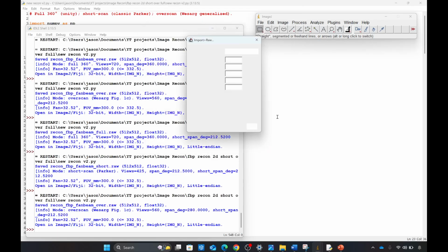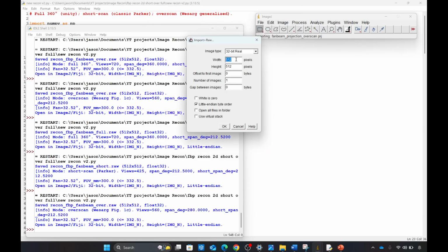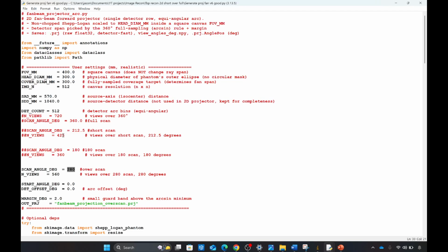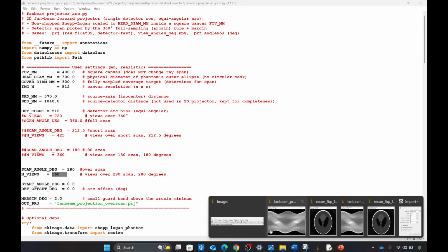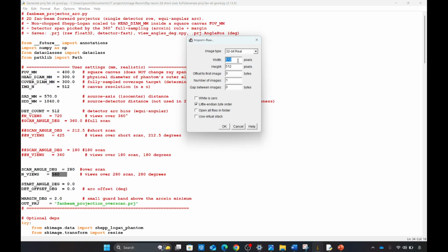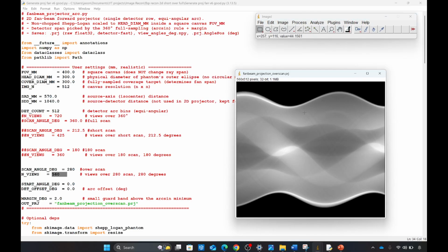It's 560 views and 512 detectors. So that is our overscan projection.